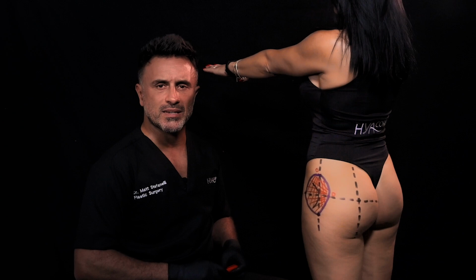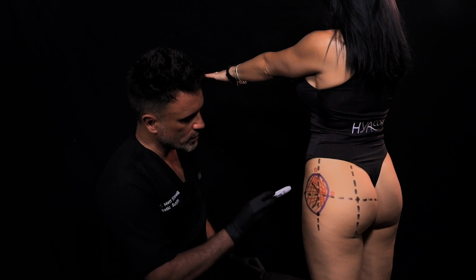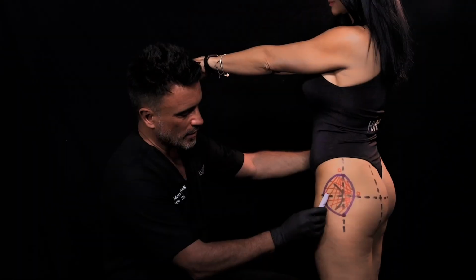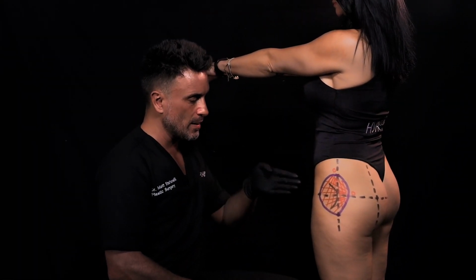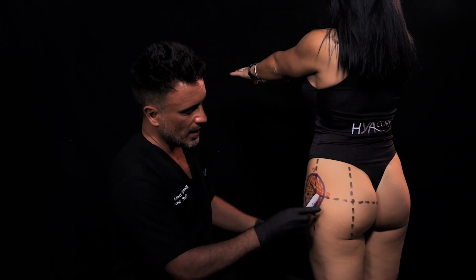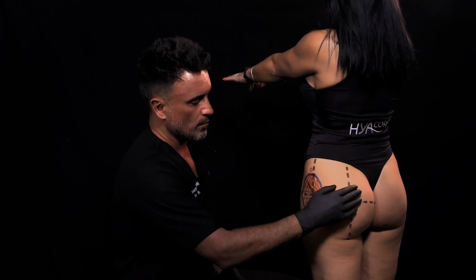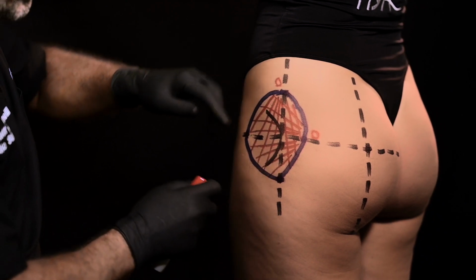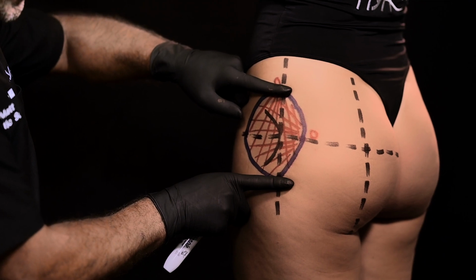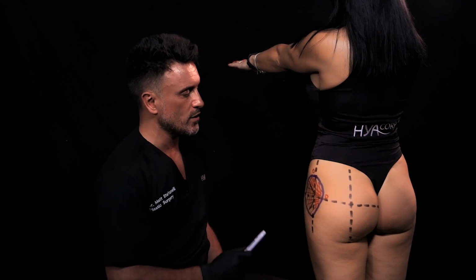So I'd like to summarize this treatment of hip dip filler. We will focus on this blue area, going quite anterior because we want to be able to see the result also from the front. And we will stop here, close to the lateral butt, because she's not complaining of the butt projection. And finally, on the vertical aspect, we will go from this point to really fill the depression. We finished the first side, and now we are going to mark the second side.